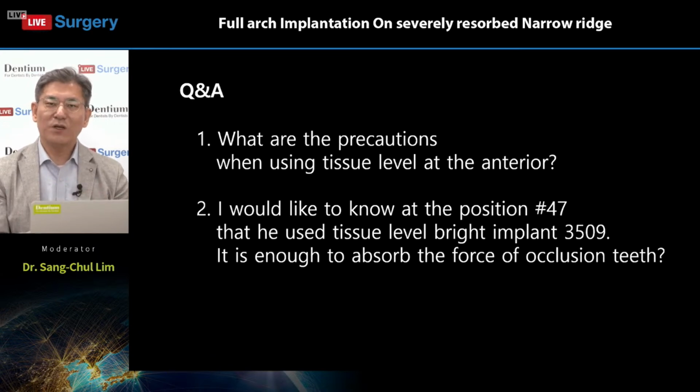We have long-term follow-up data of more than 2 years, around 2 years, using this small diameter tissue level implant from the bright system. So far so good. We need more follow-up data. However, I trust this tissue level implant, even in the lower or upper posterior area, right?